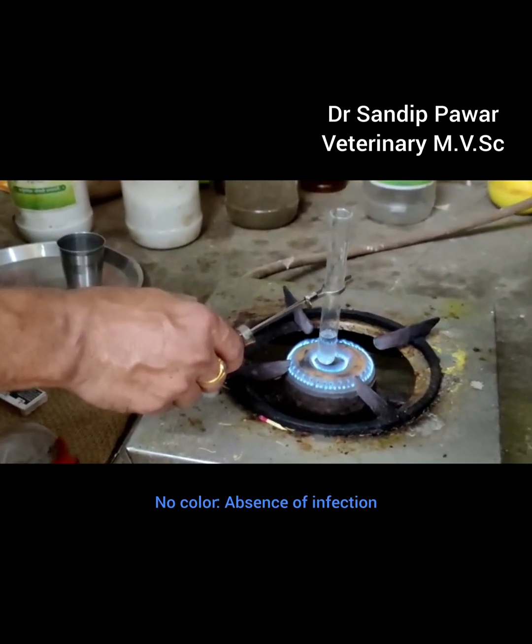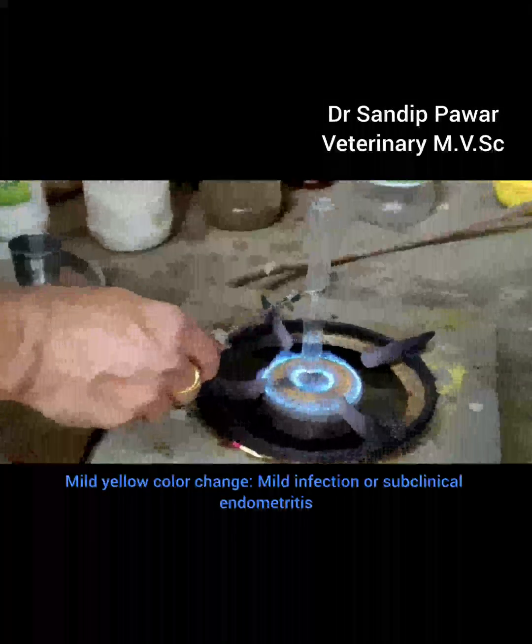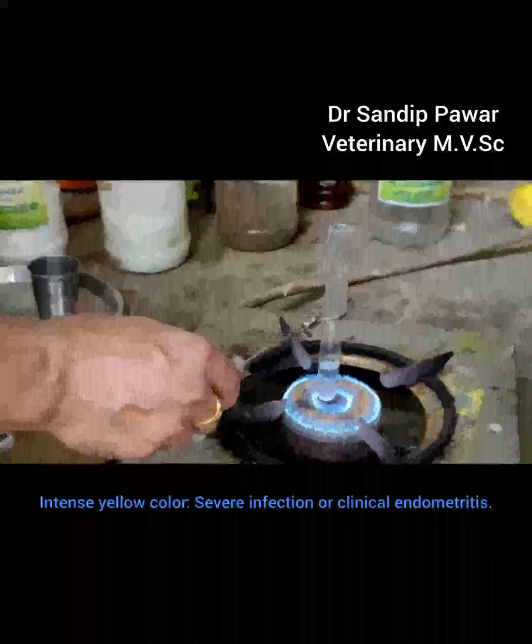No color change indicates the absence of infection. A mild yellow color change indicates mild infection or subclinical endometritis. An intense yellow color indicates severe infection or clinical endometritis.